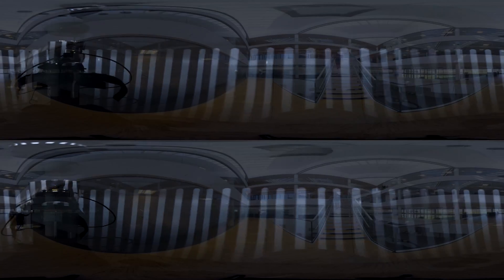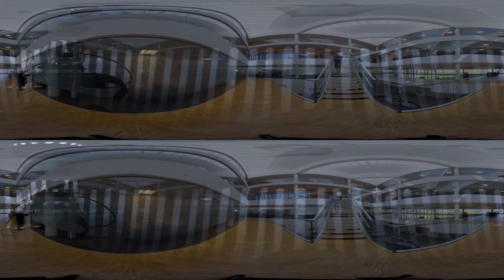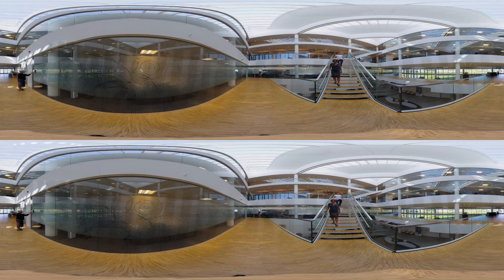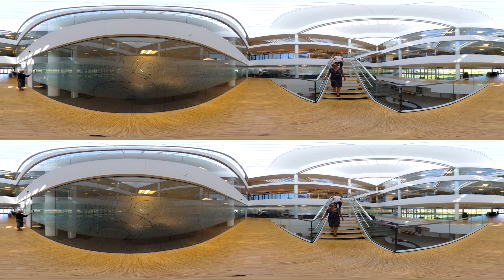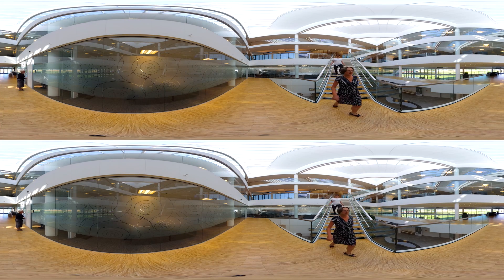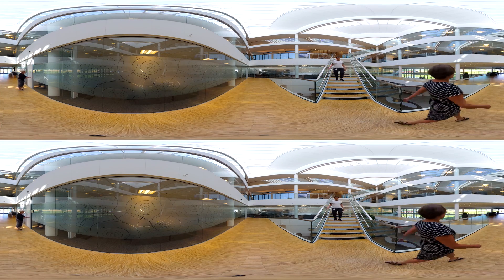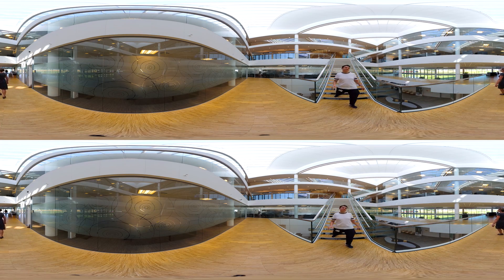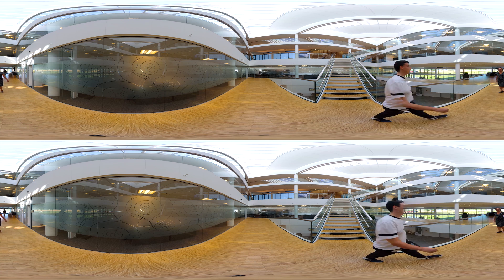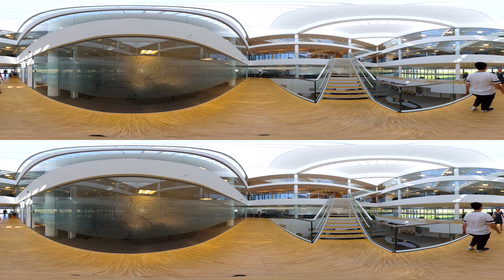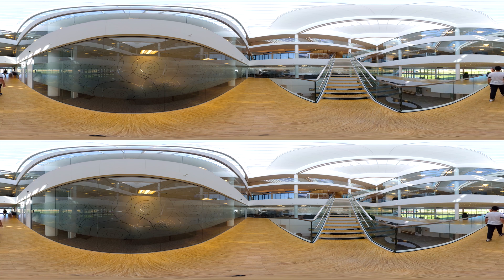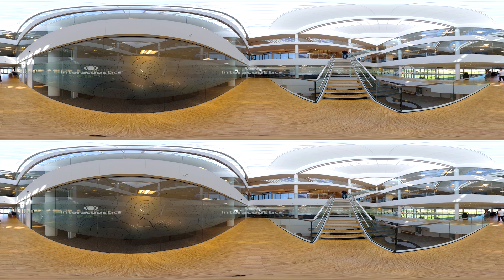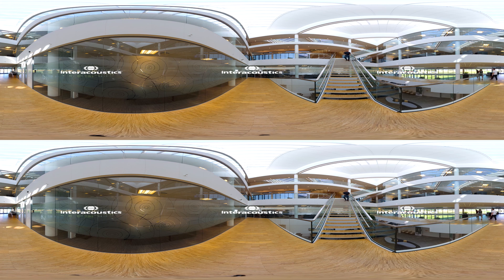Now look up. Your patient relies on you to help them scale this obstacle of dizziness, and you can rely on Visualize to help you perform gold standard vestibular testing. Visit our website at interacoustics.com to learn more of all the different Visualize solutions.